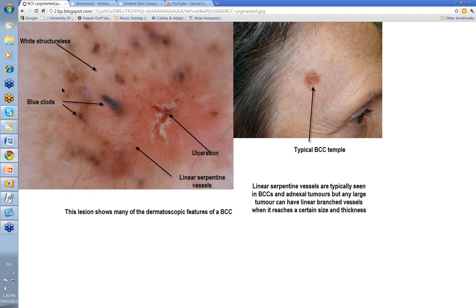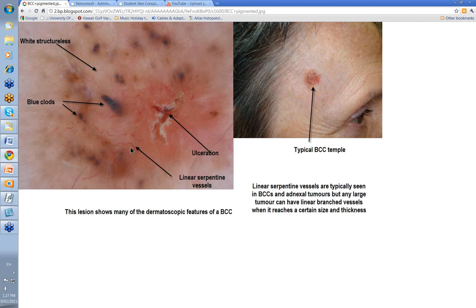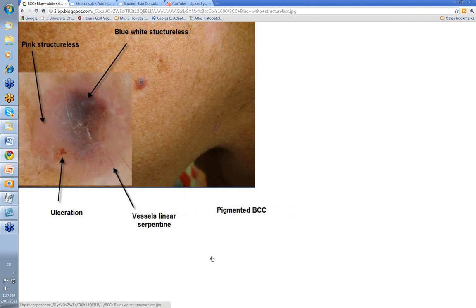Do we also have brown structureless peripheral? Not a lot here — there's a background area that may come up as brown structureless peripheral, but we'll show that a bit later. This image shows many of the dermatoscopic features of BCCs. Note the linear serpentine vessels typically seen in BCCs and adnexal tumours, though any large tumour can have linear branched vessels at a certain size. In BCCs, these vessels are usually quite sharply focused — background linear vessels in skin are usually out of focus as part of the dermal plexus.